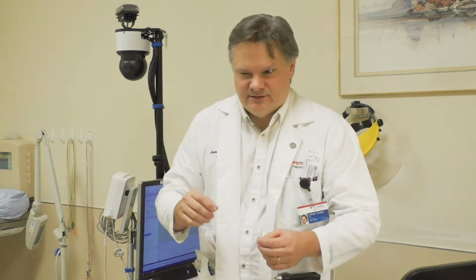You want to test motor, so have them lift up their arms. You're also testing verbal commands, and we can then see some asymmetry if there's Todd's paralysis from a seizure or something like this. Again, all of this is on your handy-dandy card. As you heard, you'll say everything out loud. That will help us. We can't see certain things. And use your card, note the time of onset.